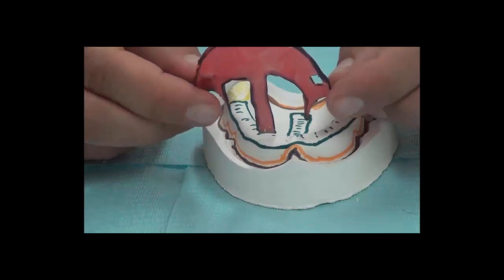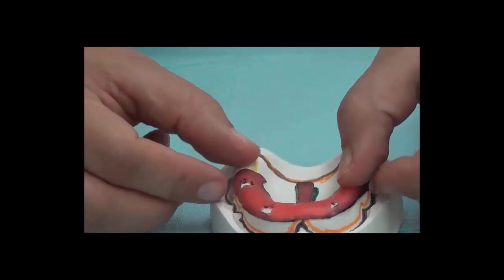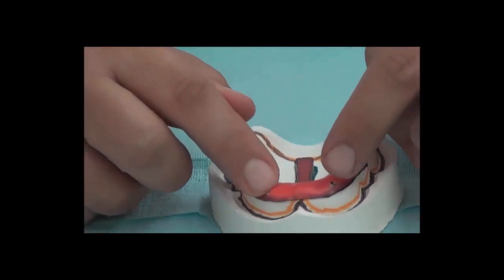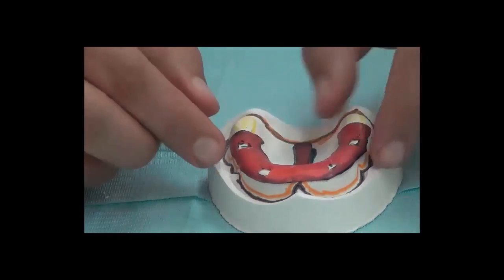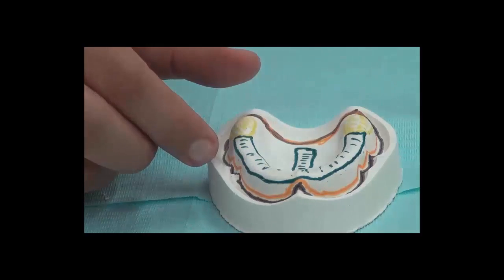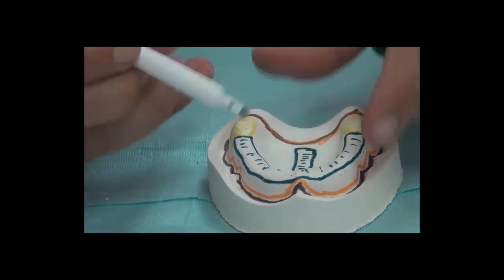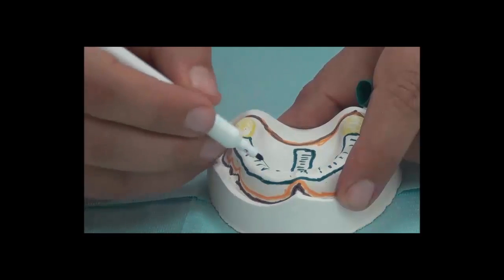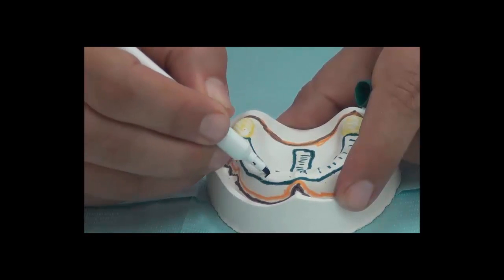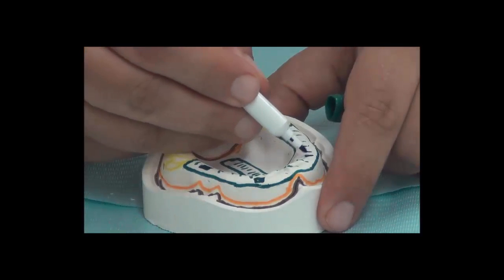In the wax relief, we place what we call stoppers. These are openings from which the acrylic will come in and touch the tissue inside the patient's mouth, so the impression is not squeezed more than required into the patient's mouth. So in the wax, we're going to place stoppers: 2 in the posterior area and 2 in the canine area. So these are stoppers.